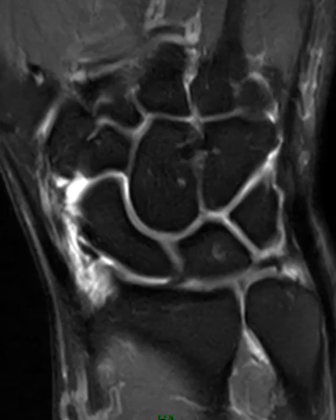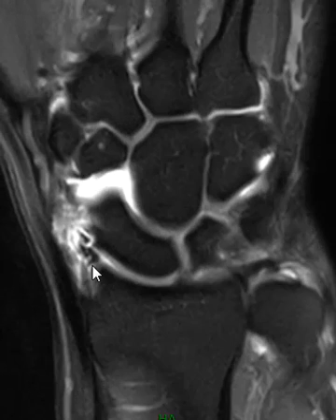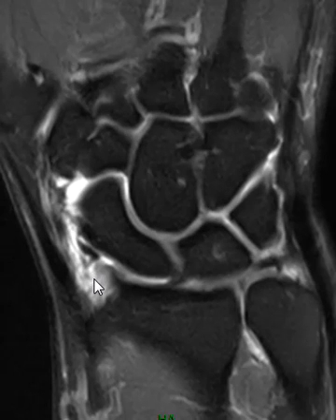Hello, this is Dr. Gay from First Look MRI, and this is a quick video about the radioscafocapitate ligament. There's a ligament over here in the radial styloid. This is the radial styloid, and off the edge of it on the palmar margin there's a broad band. It's kind of thick — the attachment — and it attaches to the scaphoid and capitate bone. So: the radioscafocapitate ligament.